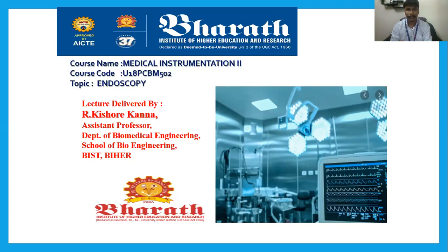Endoscopy is used to find blockages, internal diseases, defects or injuries through the endoscopy tube and through the camera which is used for viewing the internal physiology of the human body.